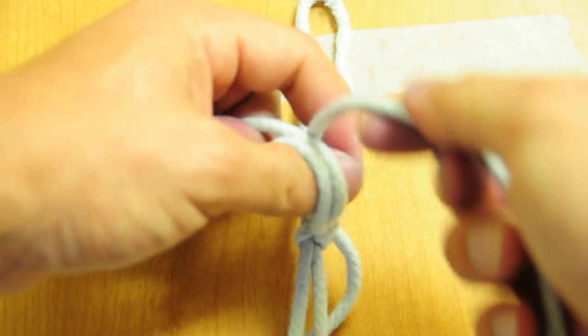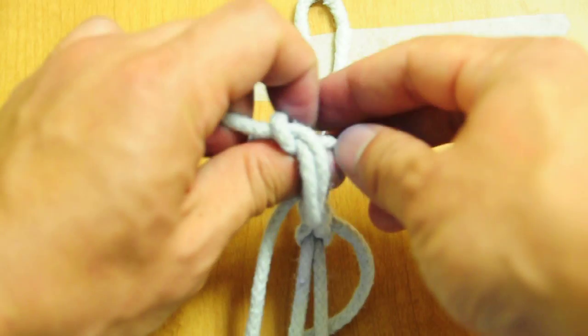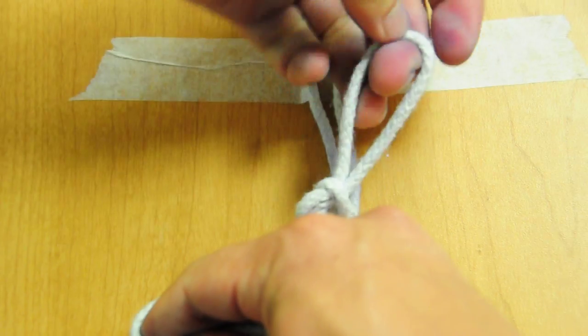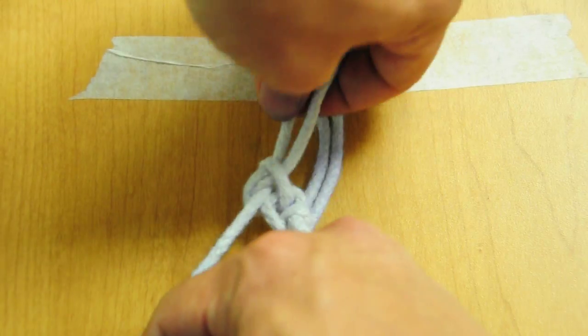And then now we're on the thumb. So same thing. Pass the free hand under. Cross your hands. Again, one, two, one, two.